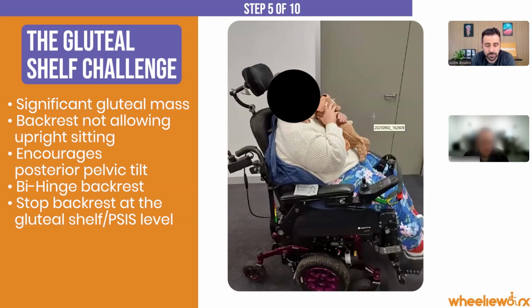And then you allow the tissue to sit underneath the backrest. That was what I wanted to do. Yeah, which is fine. It's exactly what you want to do, as long as what you want to do is maintain surface contact as much as possible everywhere else on the back. But bariatric seating is a very tricky thing. It's very tricky to get that bit right.